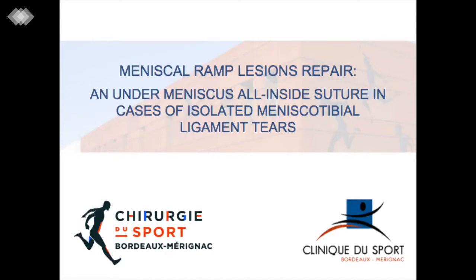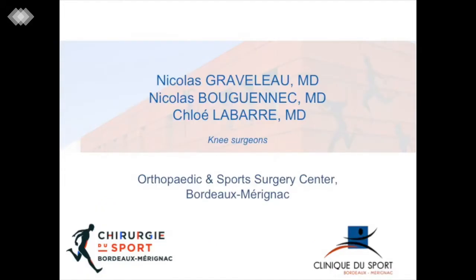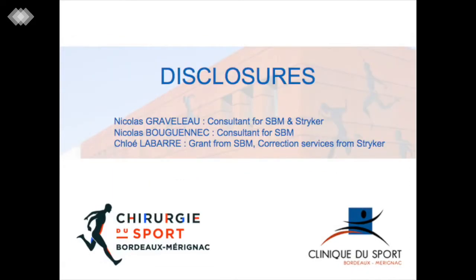This video presents our arthroscopic diagnosis and repair technique in cases of isolated meniscal tibial ligament tears. This simple procedure provides an accurate diagnosis of the meniscal tibial lesions and allows for repair with an all-inside suture device without the drawbacks of a posterior medial approach.